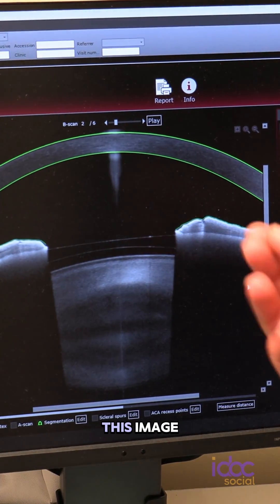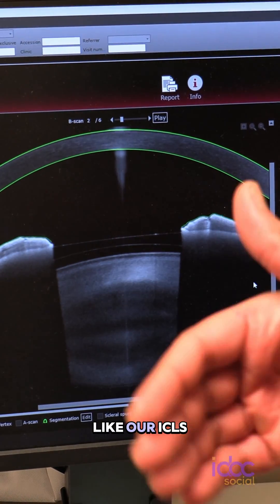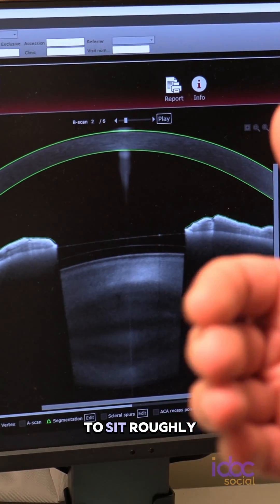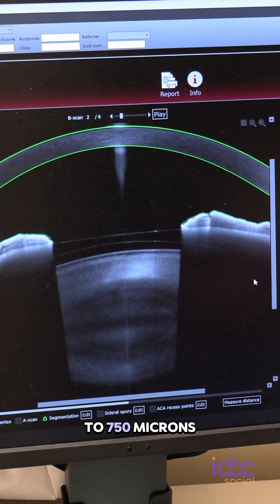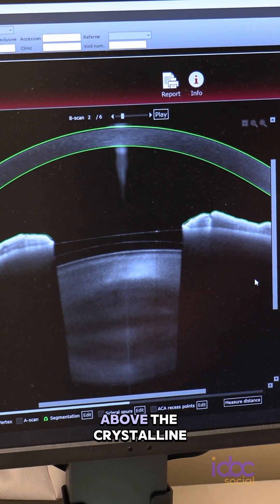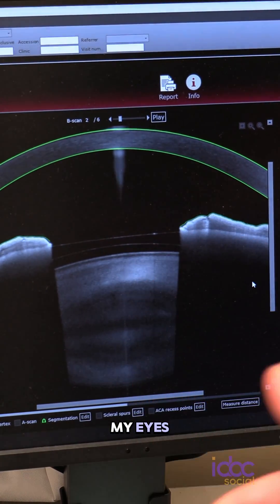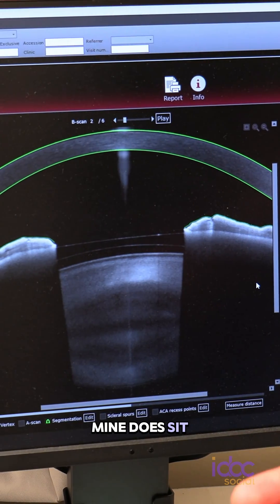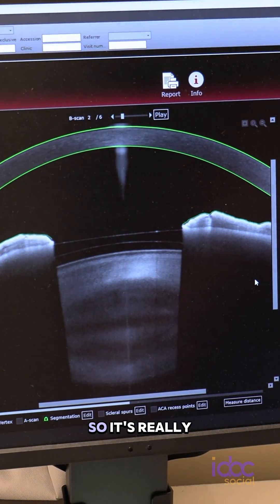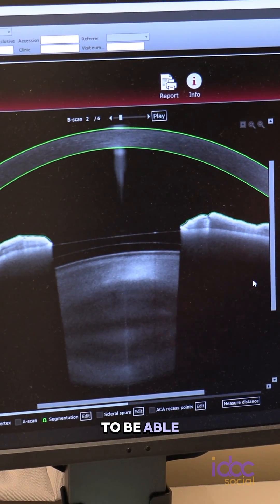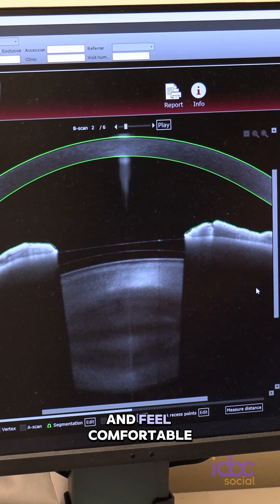Looking at this image, we do have a standard reference — we like our ICLs to sit roughly between 250 microns to 750 microns above the crystalline lens. Looking at the image for my eyes, mine does sit within that safe range. So it's really nice to be able to take these high resolution images, get that measurement, and feel comfortable and confident in the placement of that ICL for each patient.